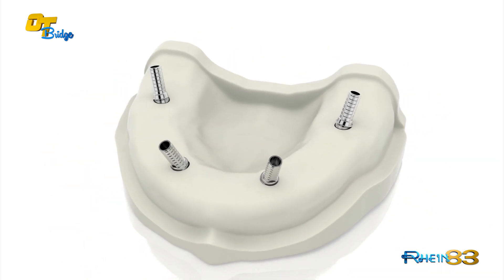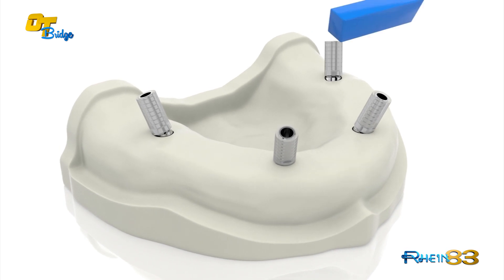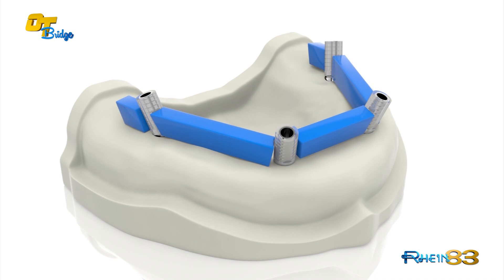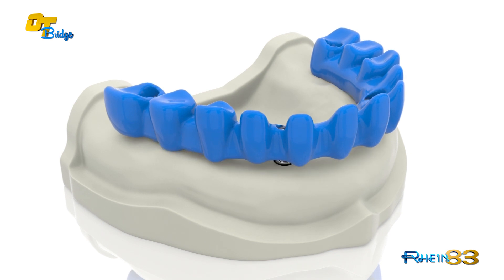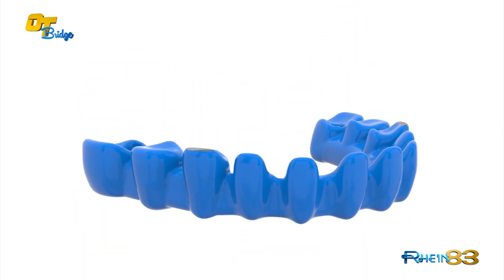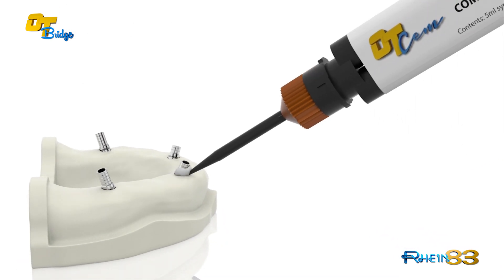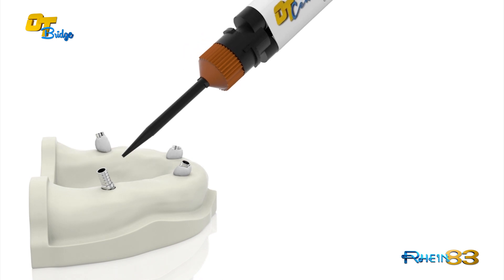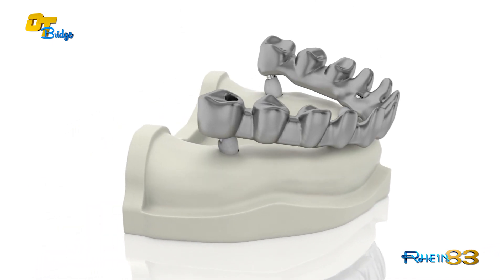Place the castable sleeve over the extra-grade titanium abutment. Connect them with a wax-up technique and cast. Bond the cast structure together with the OT Cem after the porcelain is completed, or it can be bonded immediately if covered with resin or composite.